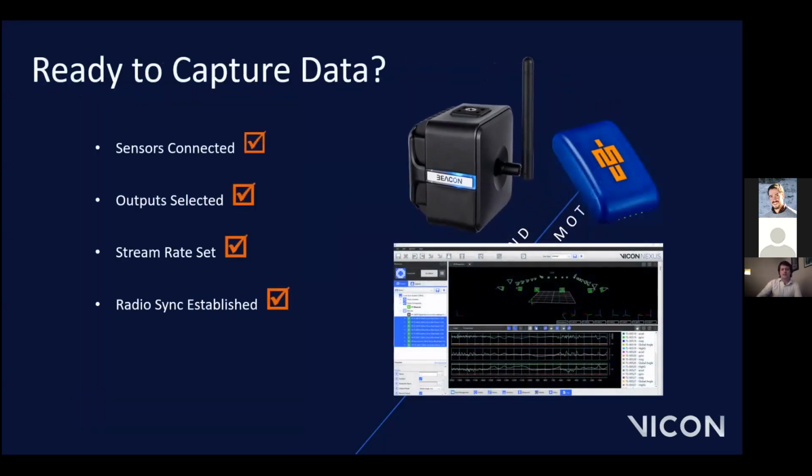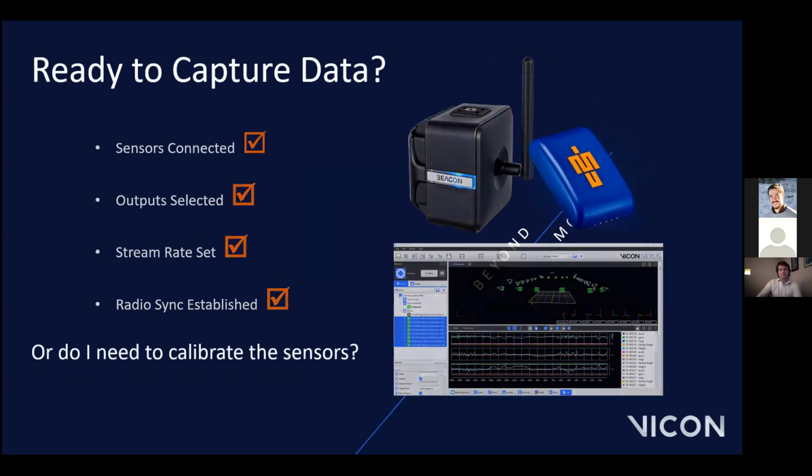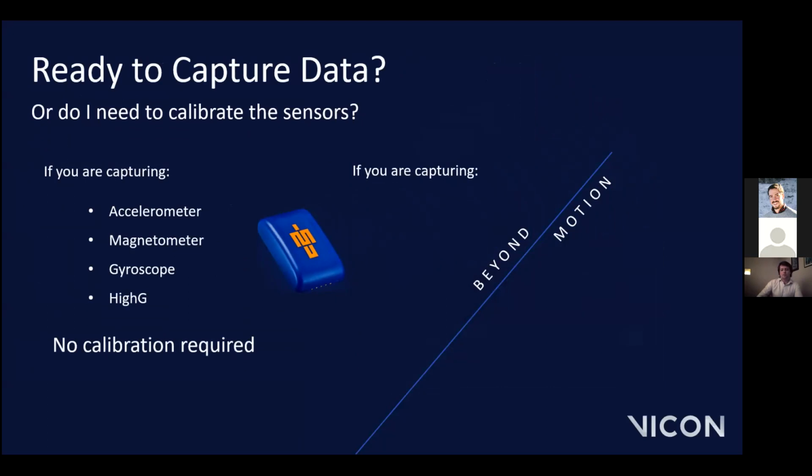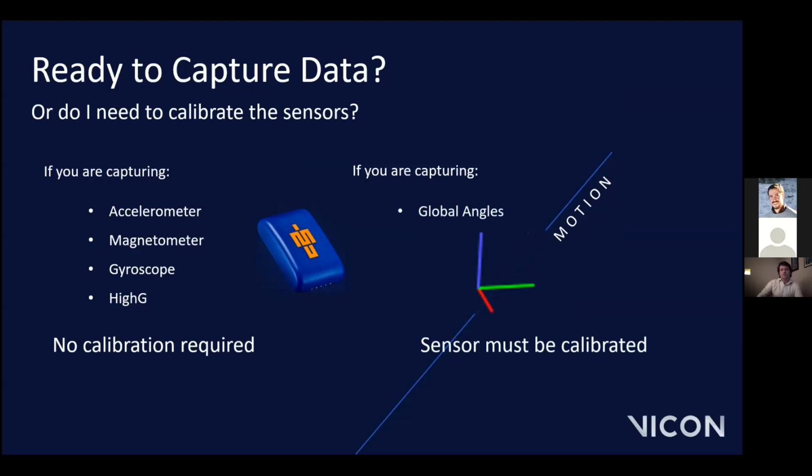So once you've got your sensors connected and streaming the required outputs, we may be ready to capture. Or do we first need to calibrate the sensor? If you are only interested in the raw data from the individual sensor components, such as the accelerometer, the magnetometer, or the gyroscope, then you can just go ahead and start capturing your trials. However, if you're also interested in the global angles, then you must first calibrate the sensor before capturing. This is to ensure that the global angles are stable and to minimize any drift.